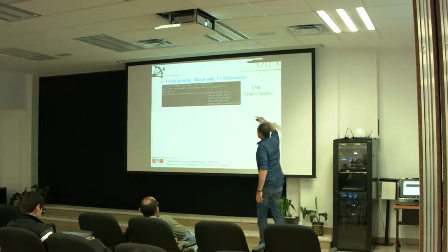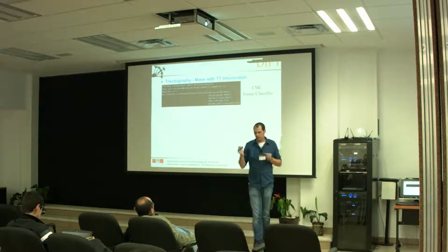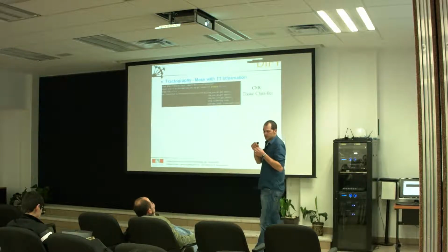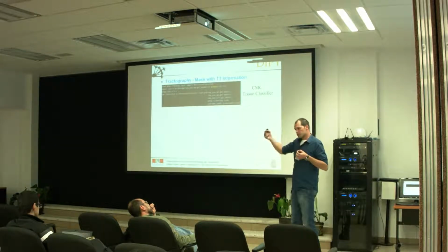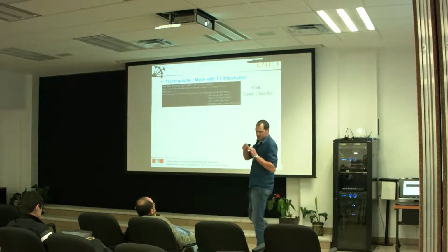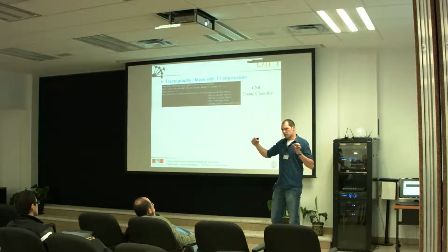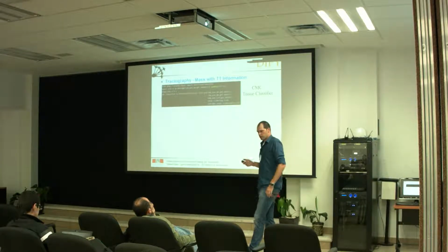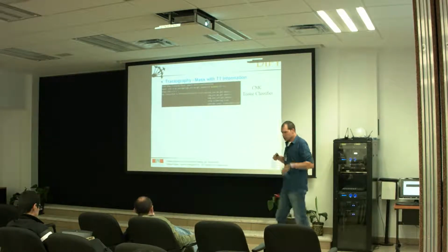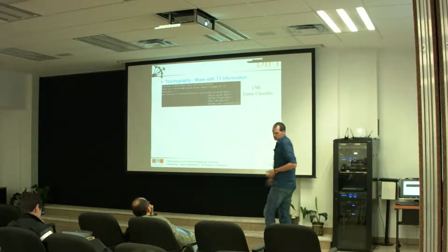For this algorithm, the way the probabilities are defined is based on the step size of tractography. I didn't show it yesterday, but you have a probability of going through the voxel with CMC that is proportional to the partial volume fraction. So if the step size is very short, you want the amount of streamlines going through the voxel to stay the same no matter what the step size is, and this should be proportional to the fraction of white matter. So you can correct the probability based on the voxel size and the step size.